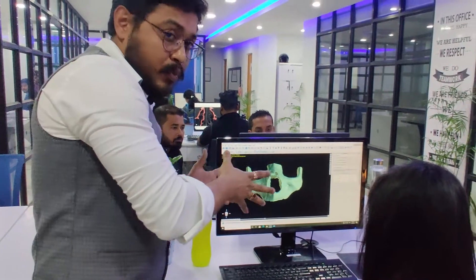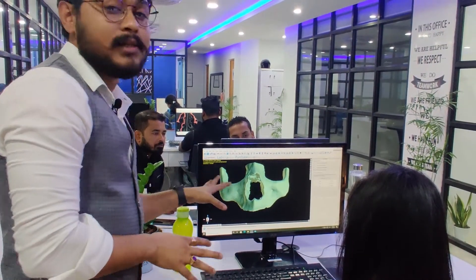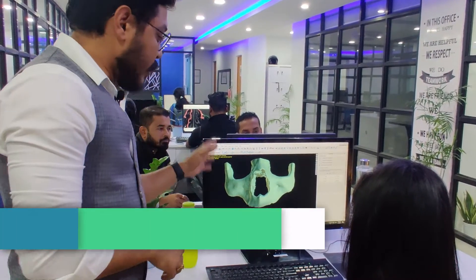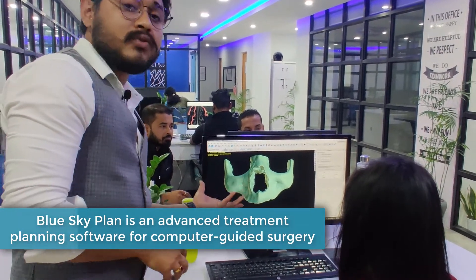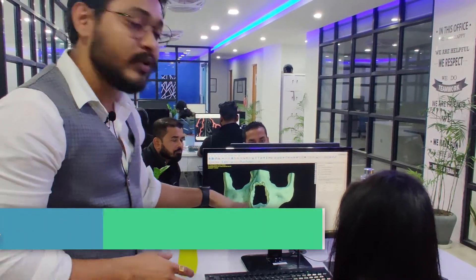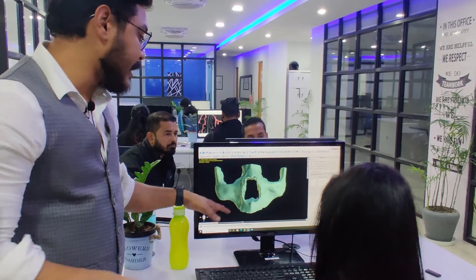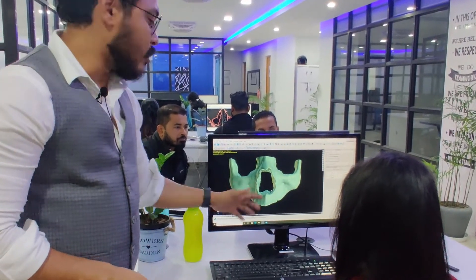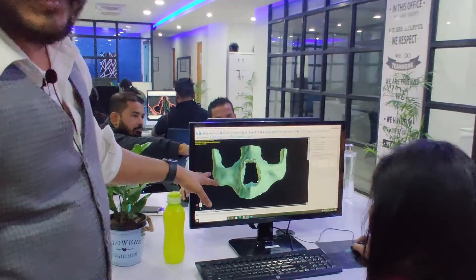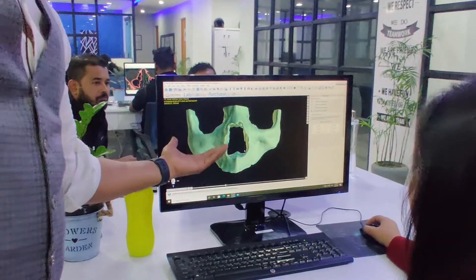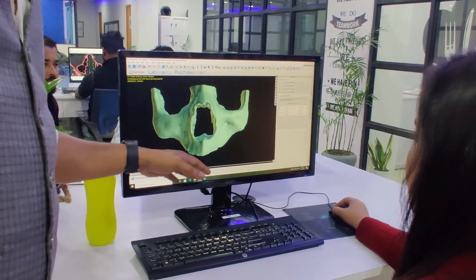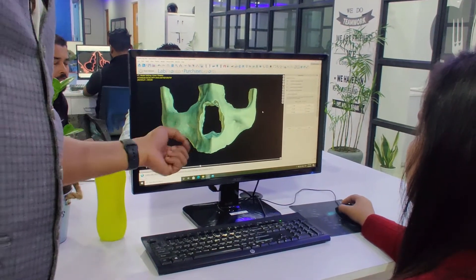After bone segmentation, this is the 3D model result we achieve from the procedure, which can be used for any kind of direct surgery planning. For example, if you are planning for a zygomatic surgery, you can plan the zygomatic implant and create the surgical guide directly from this bone model.